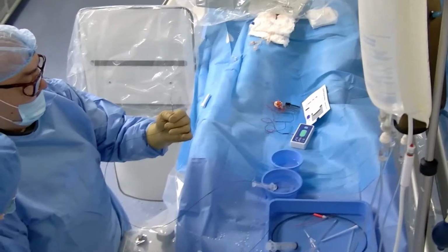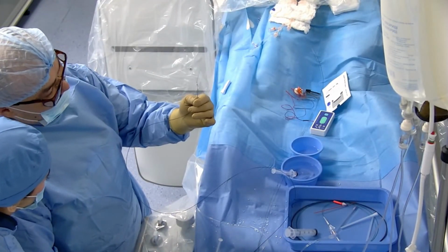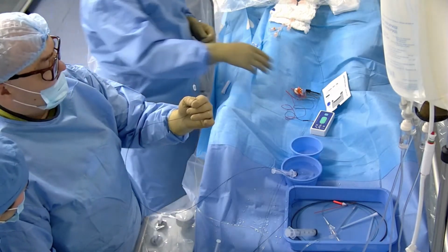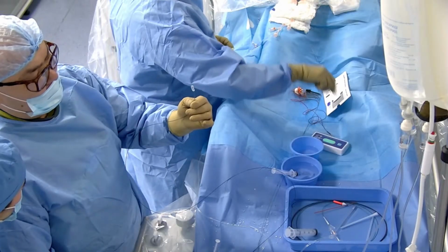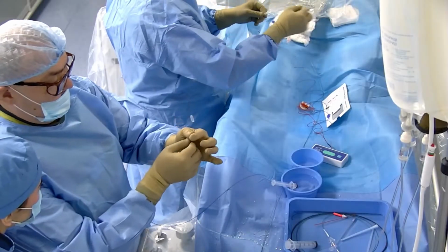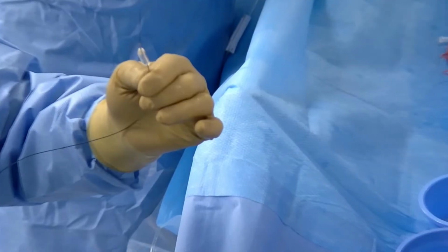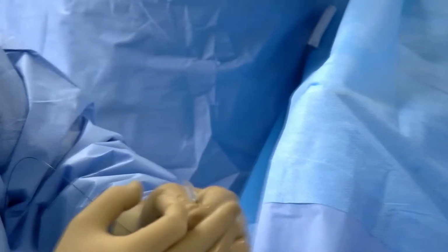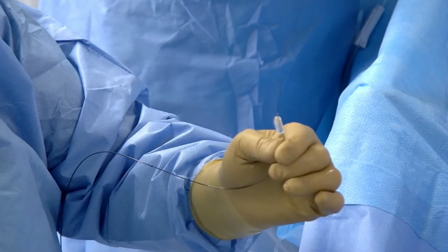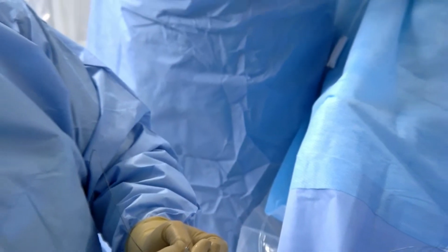AVM, but the problem is the detachment system. This detachment system is only one, and we have no other new one, and we asked the company to find us one detachment cable. And thank you to Tarlan Int company.